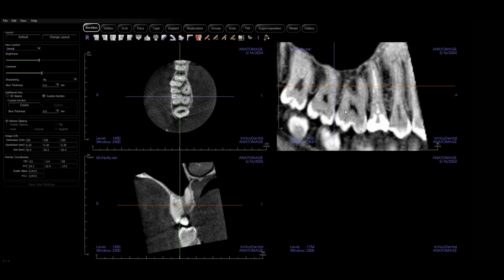Your question was really how to obturate, and I'll just summarize what you said you've done up to this point. You had a hard time using rotary files to get past maybe the apical third, and you surmised correctly that it was probably a ledge or a split or some sort of aberration in the apical third that prevented the rotary from getting down in there. So you did what you should have done, which is pre-curved K files and hand filed to a 35.